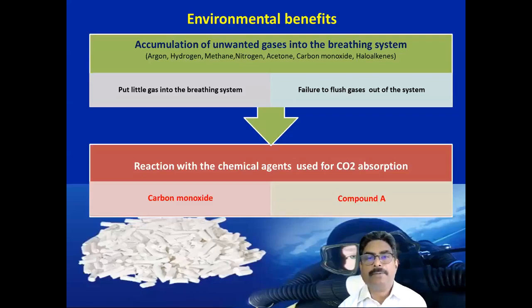Definitely it has environmental benefits because of the low inhalation anesthetics vented into the atmosphere.